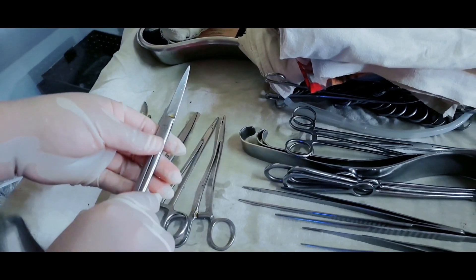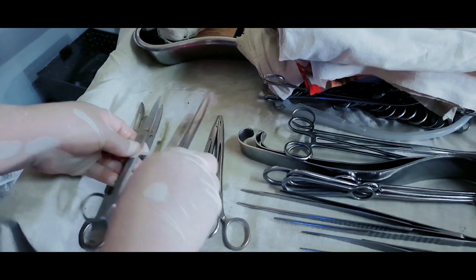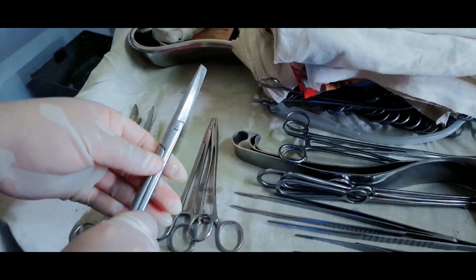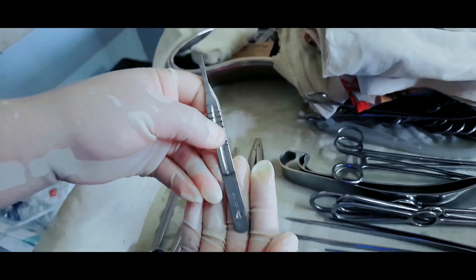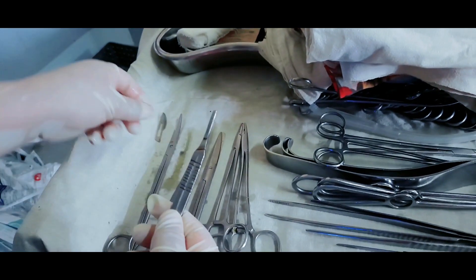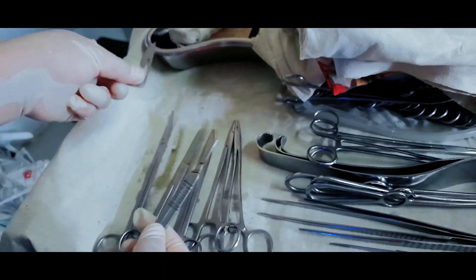Tissue cutting scissor to cut the tissue. Suture cutter — after ligation, to cut the threads. Gauze cutter to cut the gauze pieces while preparing for dressing after the operation. Surgical BP handle number 4, or scalpel, along with surgical blade number 24 for incision.